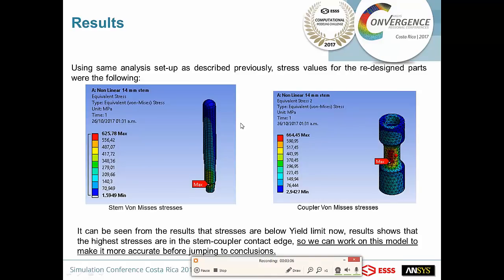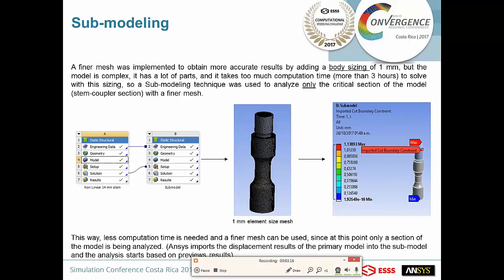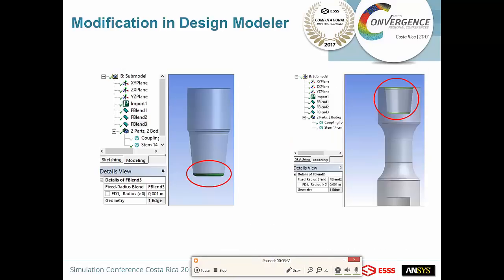So in this analysis, since it was kind of complex, we did it with a coarse mesh. We wanted to do it again with a finer mesh. So what we did was to apply the submodeling technique, in which we choose our critical parts. We applied the loads, and we run the submodeling simulation again. We also applied some fillets into the sharp edges in order to avoid higher stress at this point.